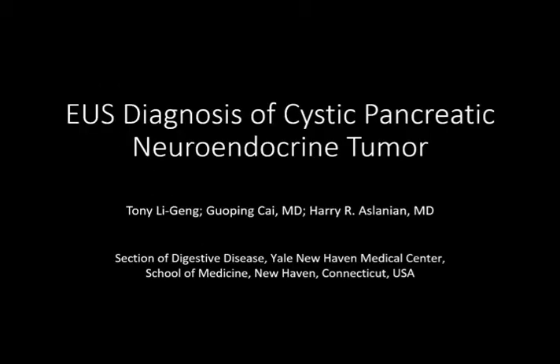We present a video series to demonstrate techniques for endoscopic ultrasound diagnosis of cystic pancreatic neuroendocrine tumors. EUS-FNA cytology identified neuroendocrine tumors in all cases. The diagnosis was confirmed with surgical pathology.